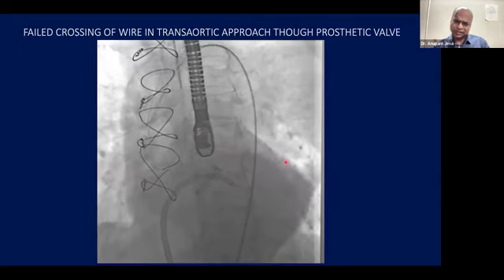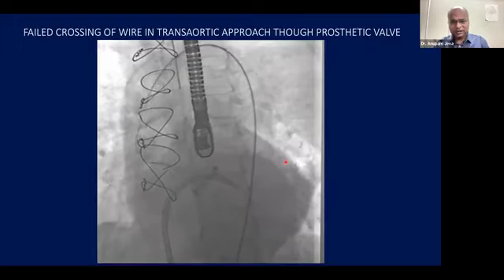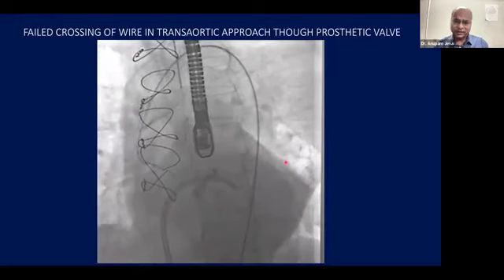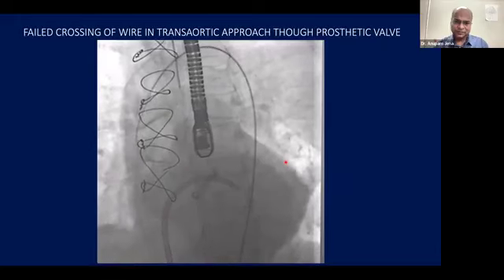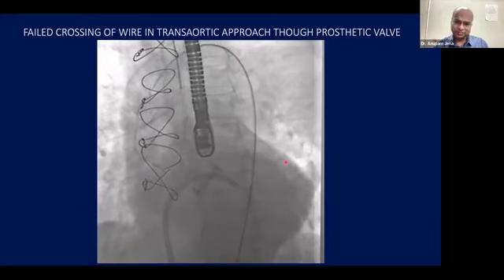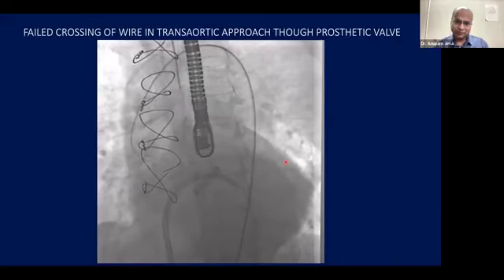We had a clear discussion that with this kind of mitral regurgitation, with this type of refractory heart failure and all the organ damage, we should at least take a chance with closing this defect. Surgeons absolutely didn't like to touch him. We thought that, okay, we'll attempt a device closure of this AML defect.